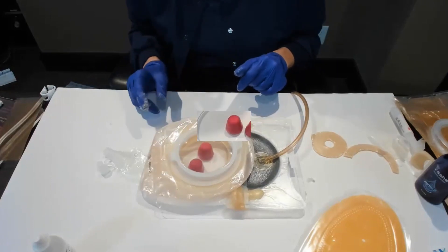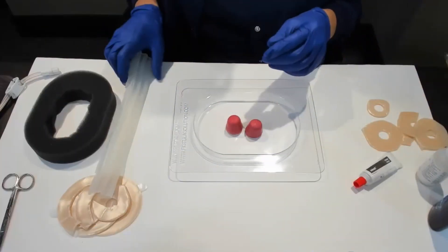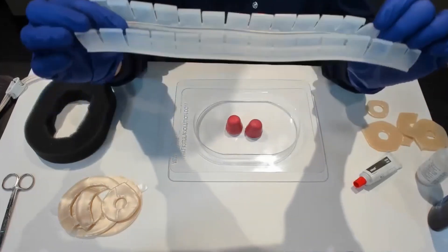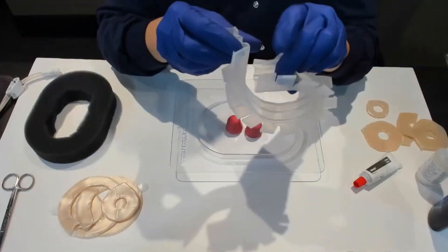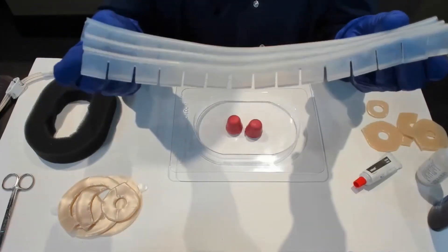That's the isolator strip. Now I'm going to go through using the isolator strip as a circle. This can be a little tricky.